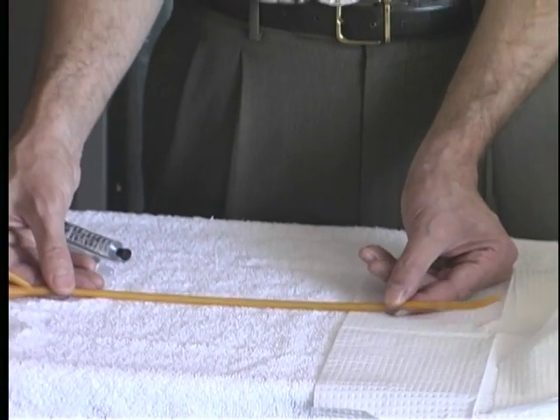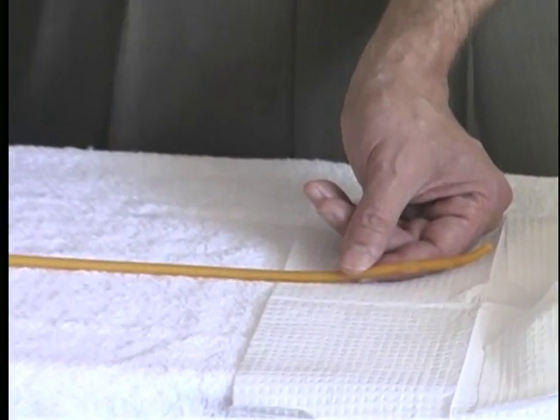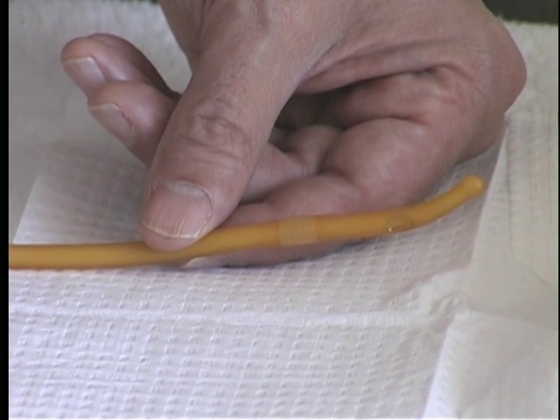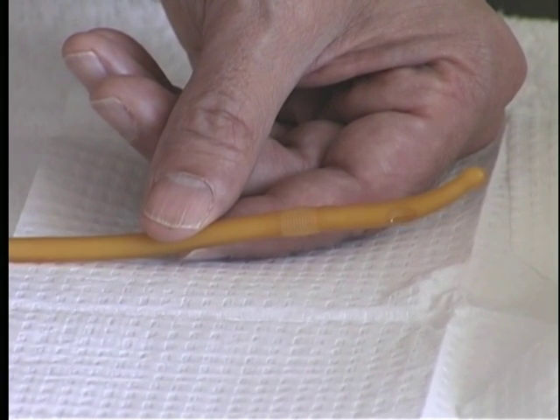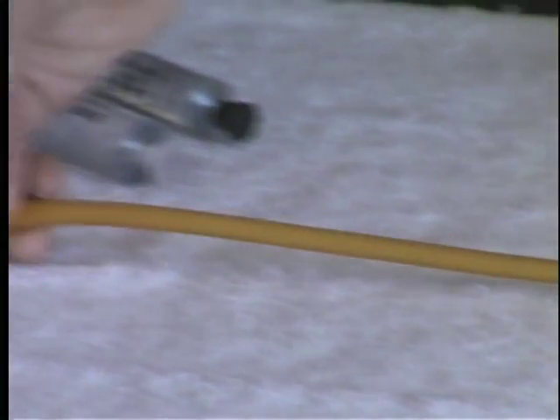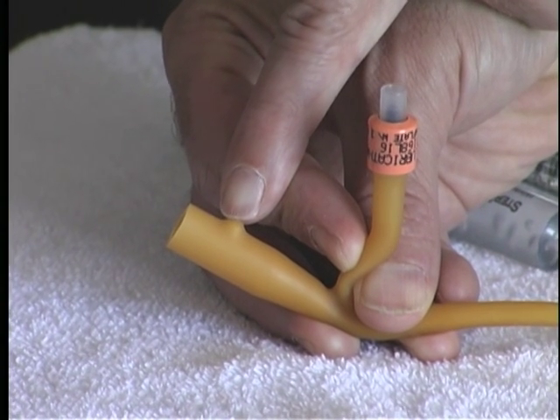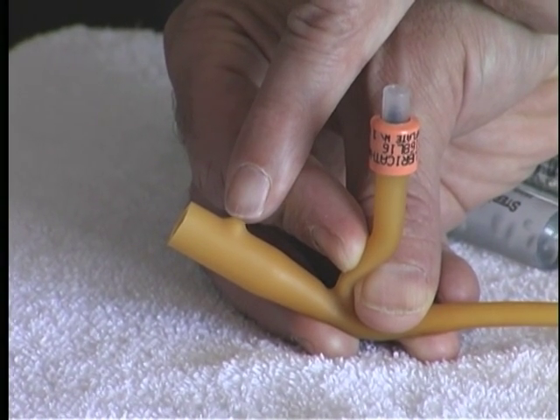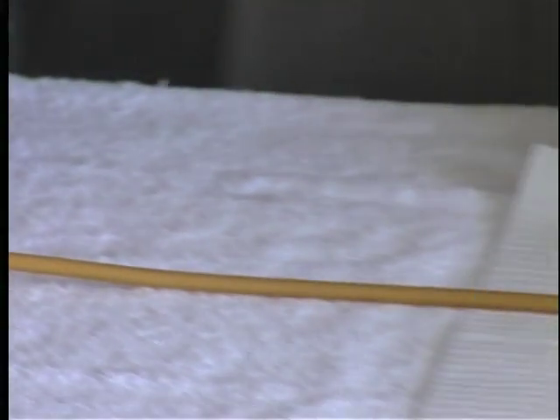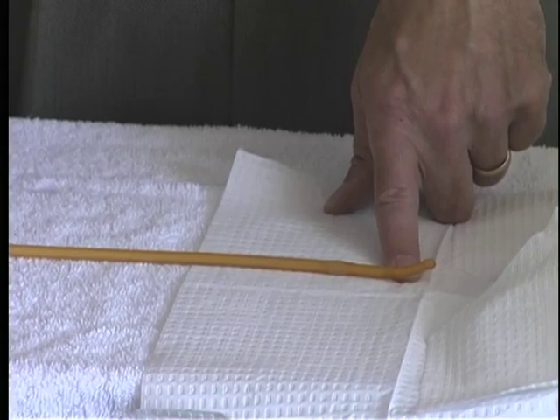When viewed from the side, the Coude catheter demonstrates its natural curve, and when inserted in this manner, this will allow for the curve to follow the natural curve of the penis, prostate, and bladder. At the hub, a small knob is identified where the catheter will be inserted into the Foley bag. This knob indicates the direction of the curve for the prostatic urethral curve of the Coude catheter.